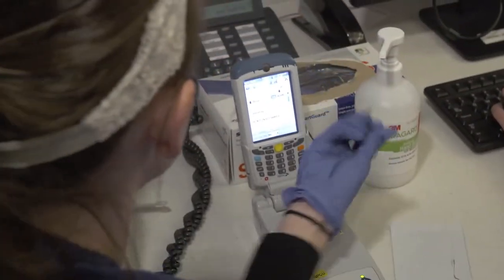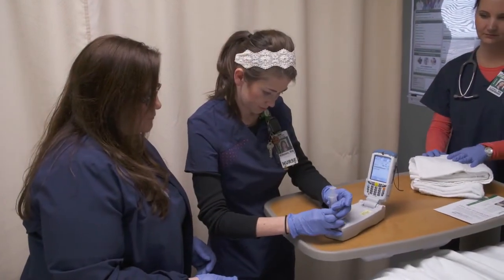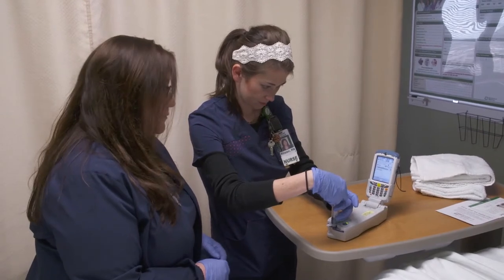If a patient is going into septic shock, we do not have minutes to spare. We have got to get it done quickly. So when you get the little beep from the EPOC that says your results are in, you go with it. You don't even think twice about it. You're like, this is good. This is what I'm gonna do for this patient. The next steps are clear.